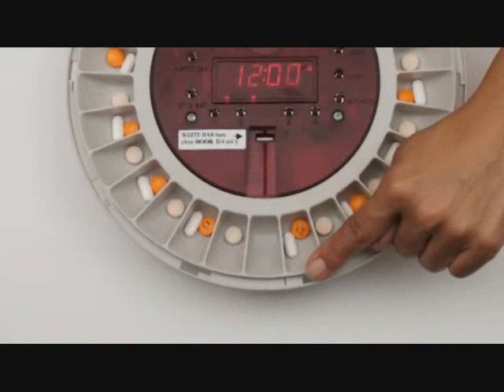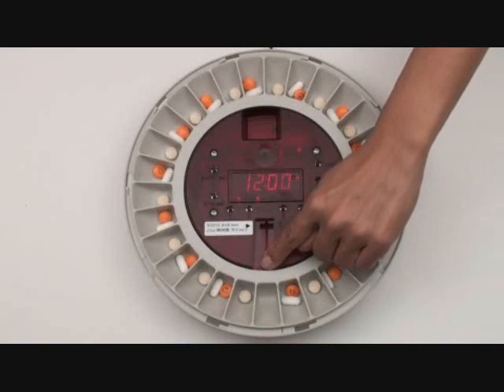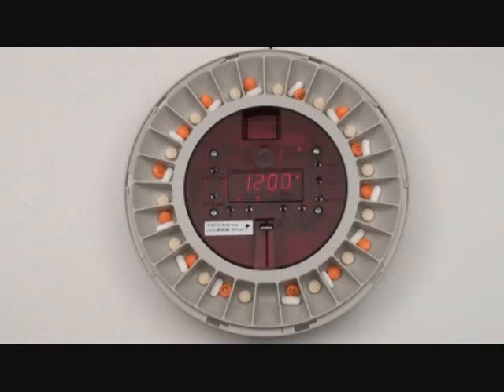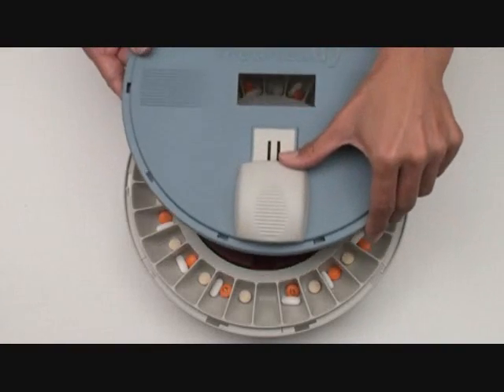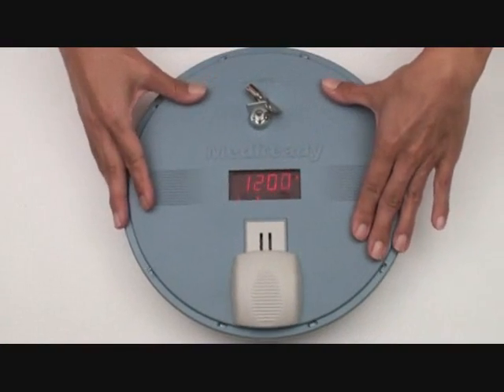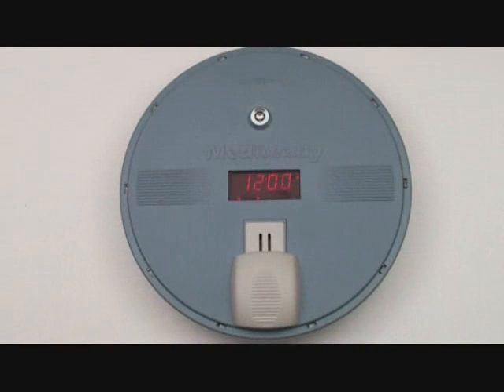Again, before closing the unit, align the empty cup to the left of the alignment mark. Make sure the white bar is all the way up next to the X. Ensure that the white door is closed before replacing the lid. Place the lid on slightly clockwise and rotate it counter-clockwise to secure it into position, then remove the key.